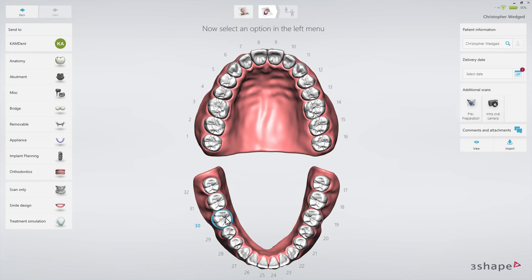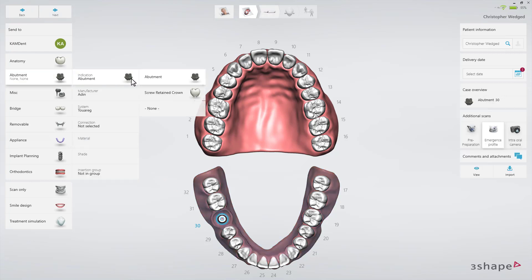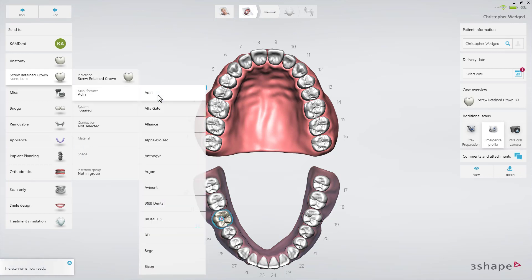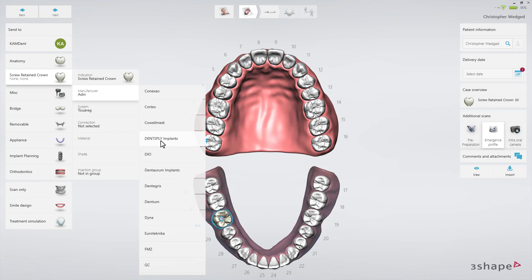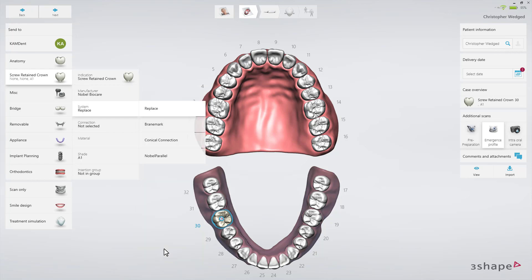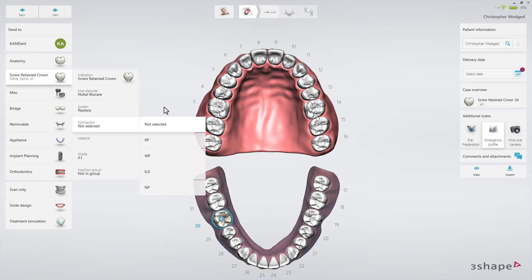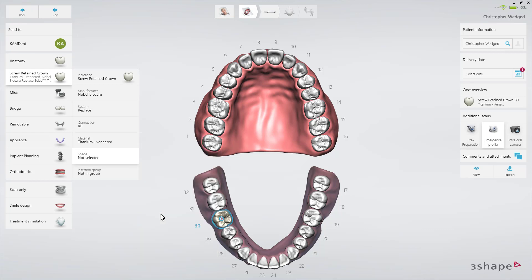Mark the tooth that needs to be restored and click on the Abutment tab. Then select Abutment or Screw Retained Crown from the Abutment drop-down list. Now select the Implant Brand from the Manufacturer drop-down list, then select the Implant System from the System drop-down list, and specify the connection of the platform from the Connection drop-down list. Finally, select the Restoration Material from the Material drop-down list.